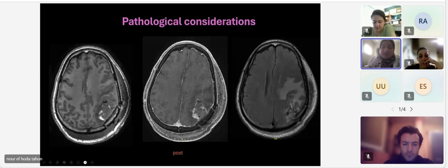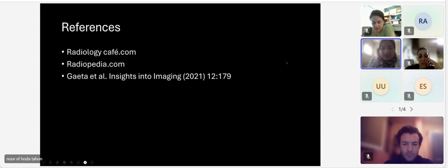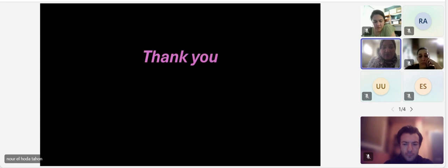It can subtract the hemorrhage and just show you the enhancement of the gadolinium. And still you have some mass effect, and you have vasogenic edema here, and here the ventricle is effaced, totally effaced. All right, that's all that I have.